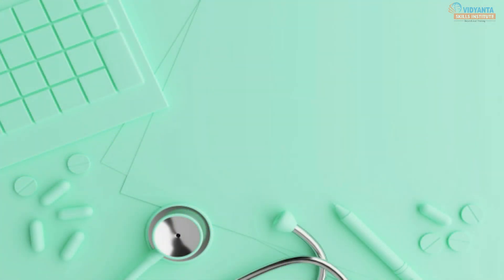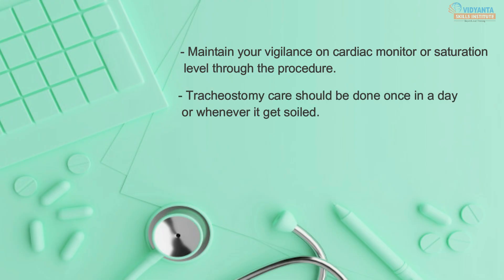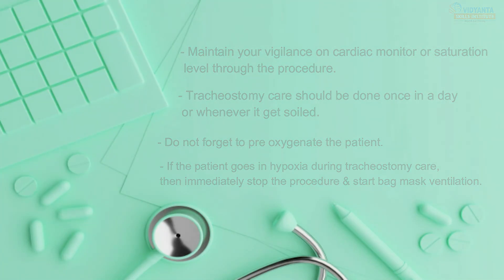Key points to remember: Maintain vigilance on the cardiac monitor or saturation level throughout the procedure. Tracheostomy care should be done once a day or whenever it gets soiled. Do not forget to pre-oxygenate the patient. If the patient goes into hypoxia during tracheostomy care, immediately stop the procedure and start bag mask ventilation.